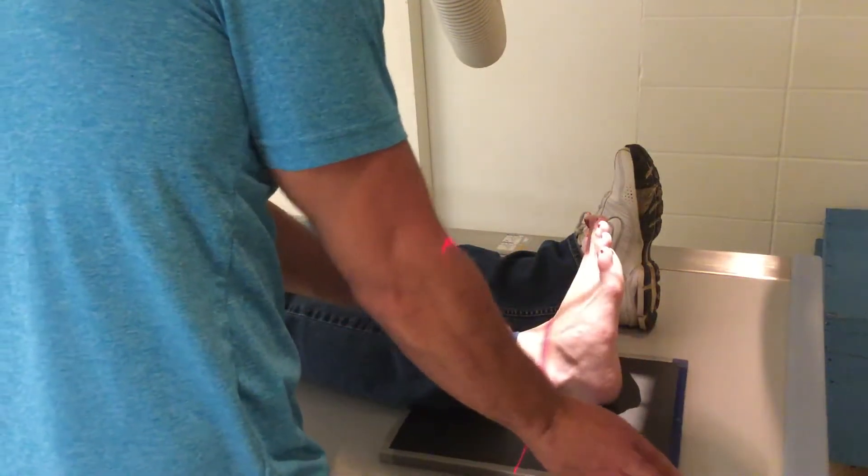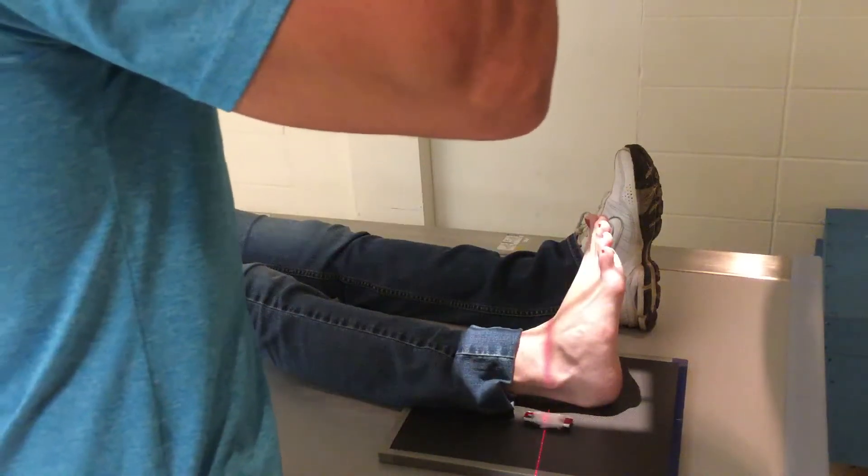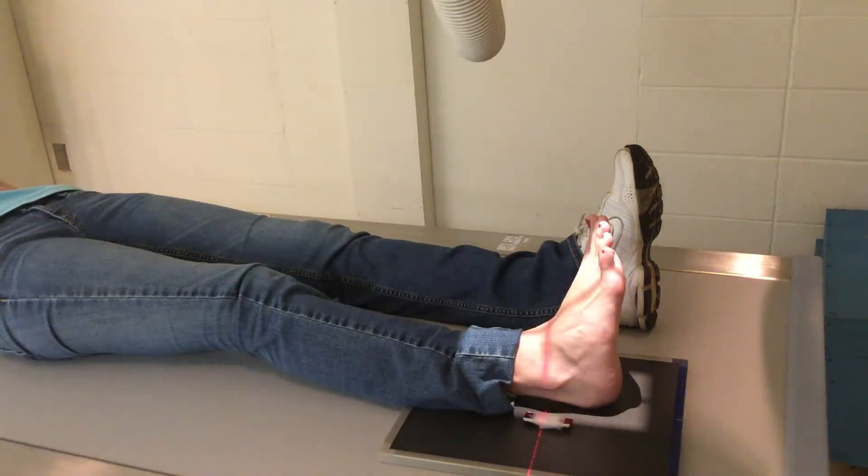So you dorsiflex, roll in, mark, and just make sure you're nice and centered where you need to be. Cone in again — I like to include the heel. Not a big change from the AP to the mortise, but that's about it. Make sure your marker's in the light.